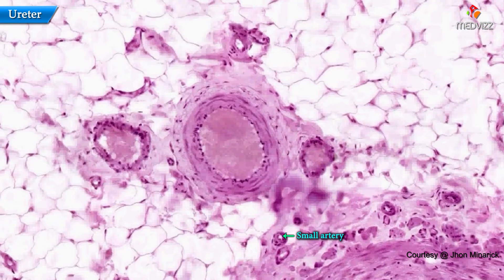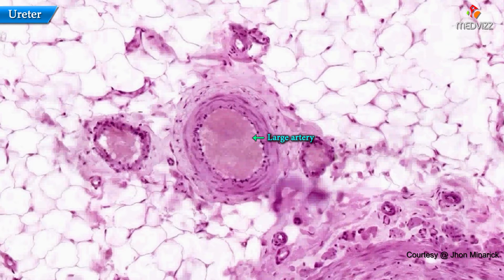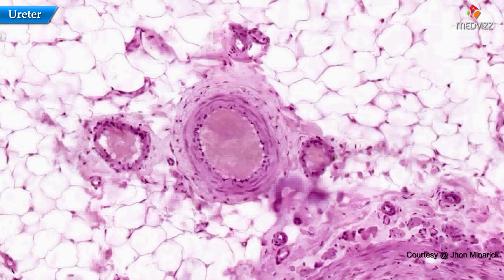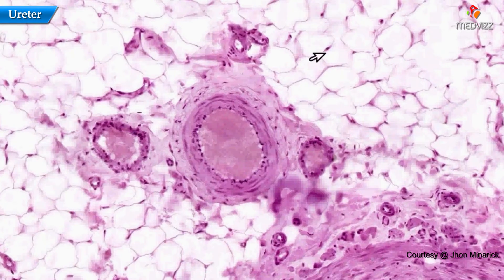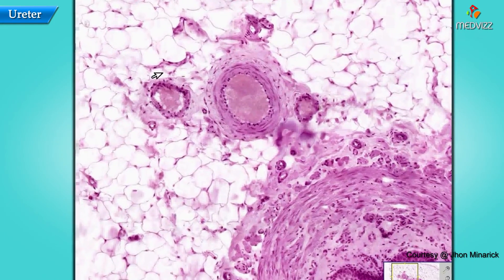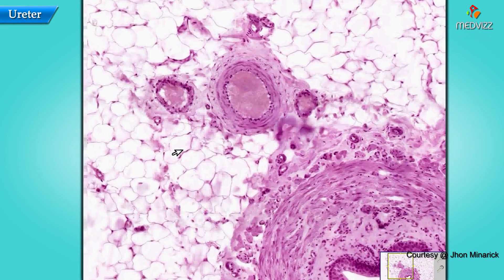Here's a small artery, and here is the wall of a large artery. And here is the fat or loose connective tissue pretty much surrounding everything — this is retroperitoneal fat. No need to waste our time anymore on the ureter.